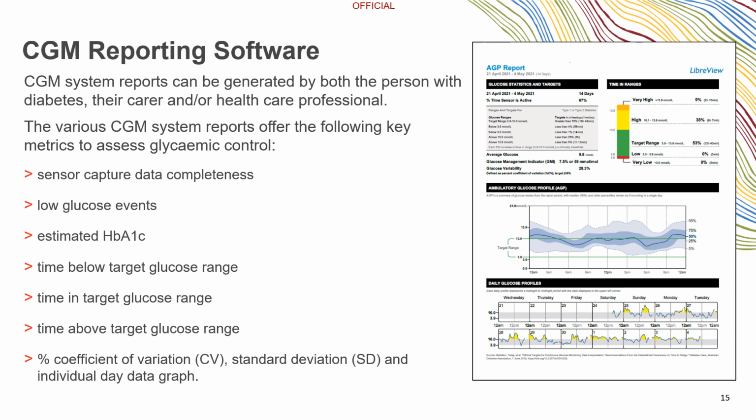Reports to identify the glycemic control of a person with diabetes admitted to a hospital will require referral to the diabetes specialist nurse or credentialed diabetes educator and will be dependent on the availability of the appropriate software.